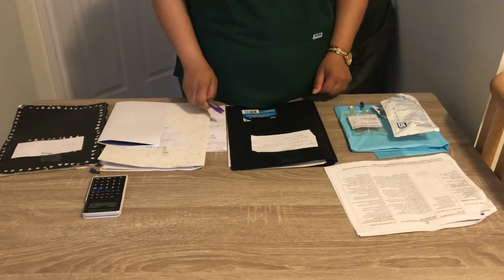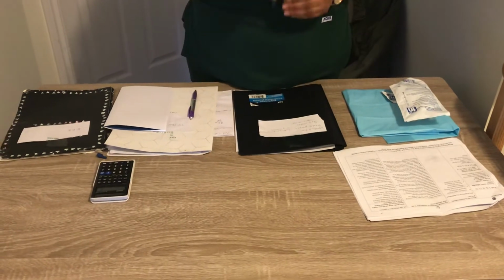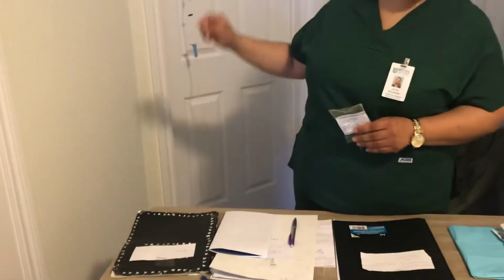Good morning, my name is Joyce, and this is my formal critique for IV meds. I have my pre-mixed cefazolin bag, and I have my main line already up and running.